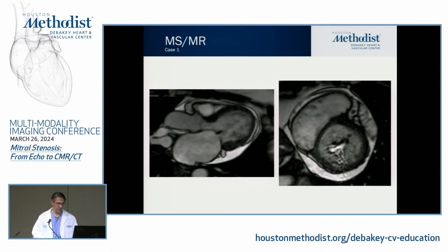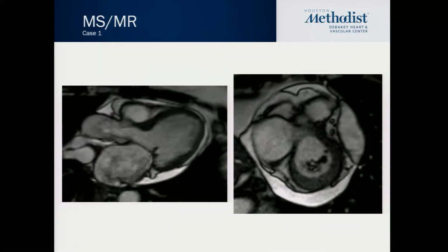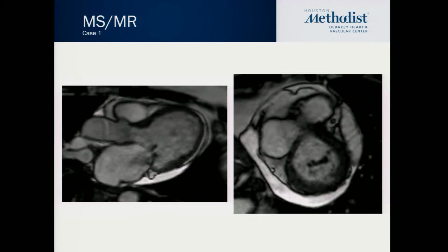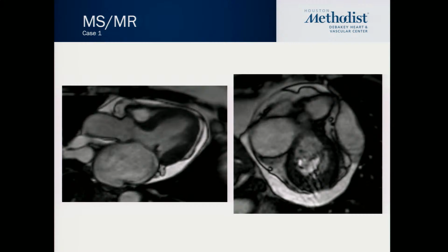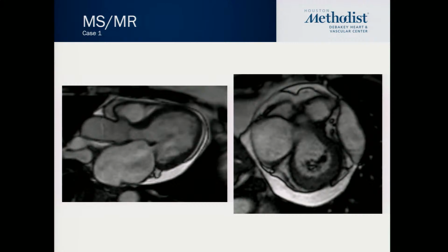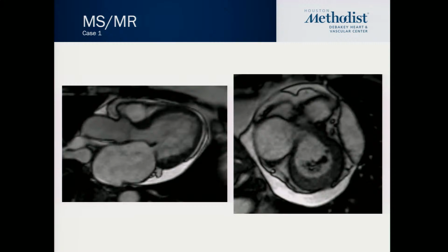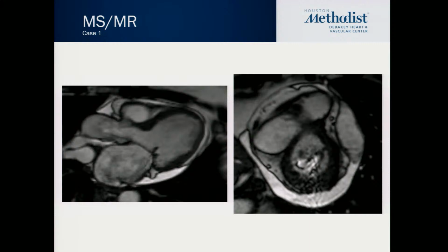These are just some examples of how we can see that same pathophysiology with cardiac MRI. This is a patient who, you can see in the three-chamber view, has very thickened leaflets. You can get that hockey stick appearance. There's associated mitral regurgitation in this case. And if you look at the short axis, you can see that the valve doesn't seem to open as well and maybe has a fish mouth appearance as well. You can see the size of the left atrium, how big it is. And to some degree, as image quality improves, you can see the subvalvular apparatus as well.